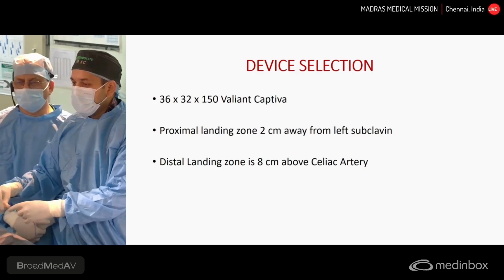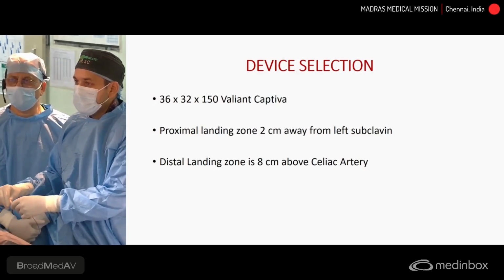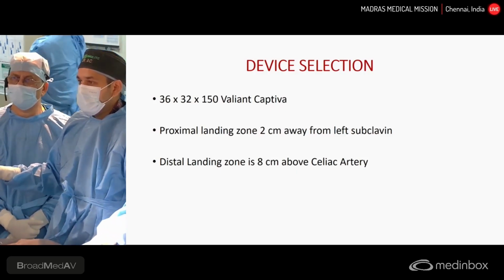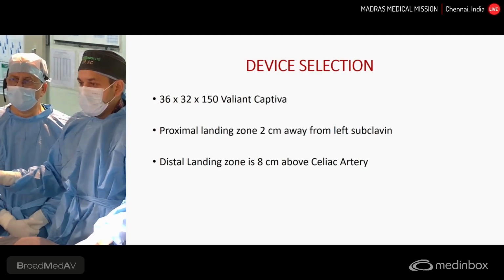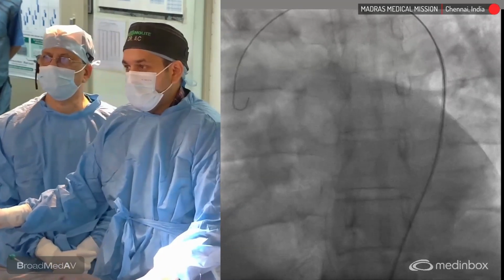Initially, first we are planning to do a coronary angiogram because previously we had a bad experience of doing a primary after a TEVAR procedure. Since he is hypertensive, 61, with evidence of atherosclerosis, we are going to do an angiogram before proceeding.